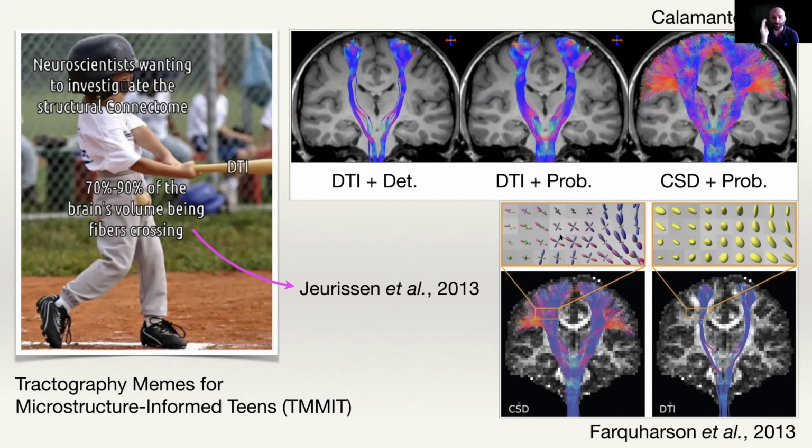And like the top of the modeling stuff is usually done on a single fiber level to some extent. It's very hard to get a crossing fiber. So there's a lot of work that can be done on this, definitely, yes.